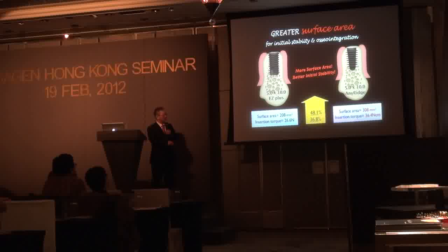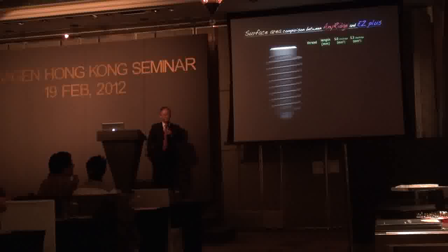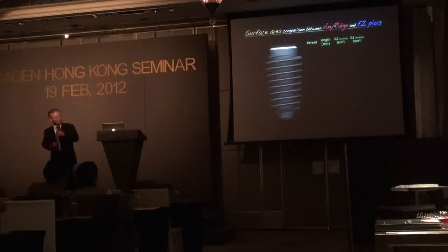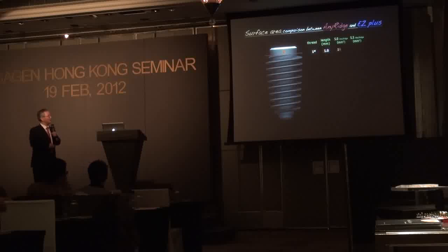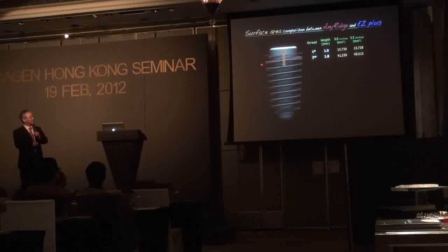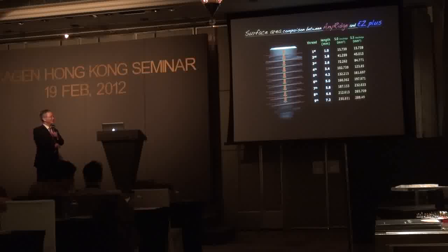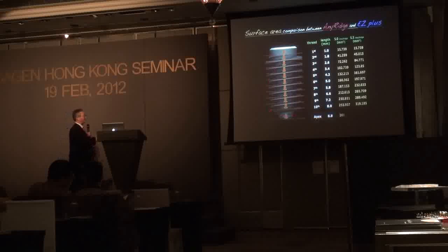It's a lot. And insertion torque. Insertion torque means initial stability. Insertion torque increased almost 40% again. And I made some interesting game. I calculated the surface area from the top to each thread, to the fourth, fifth thread. We have a computer program to calculate all the surface areas. And then I made this note.